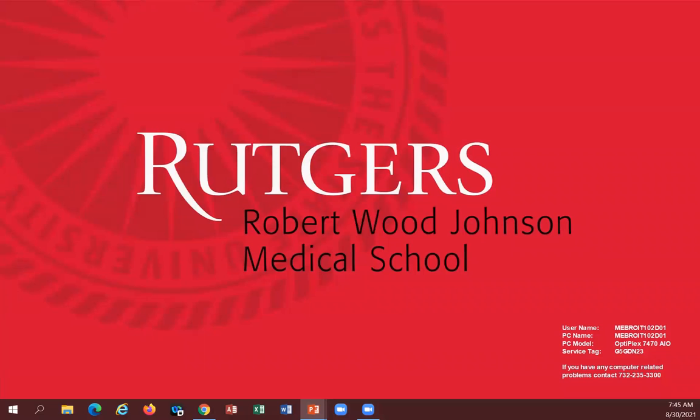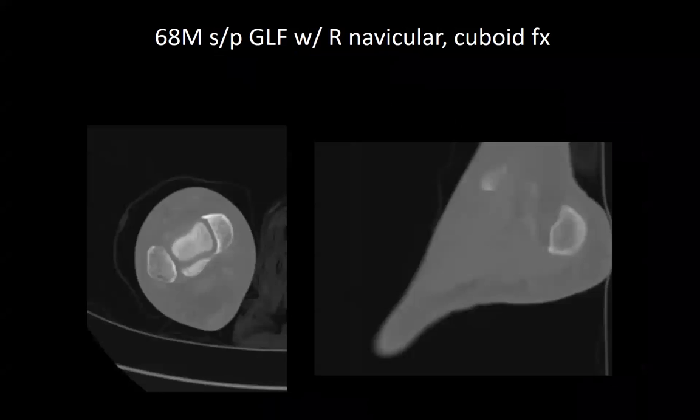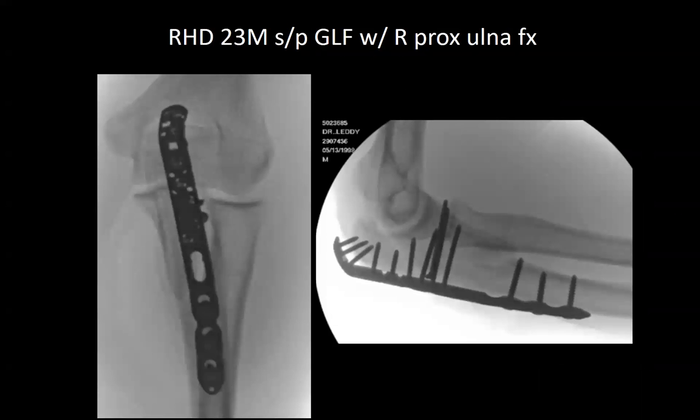The screws on the last case, it looks like they're going anterior to the bone. Do you have x-rays showing that they're in the bone? You mean anterior to the coronoid? You have better x-rays showing that that's definitely perfectly in the bone, right? Saying this one here? Yeah. When we took our set, this one doesn't look as good. But when we took our fluoro, we did it live, and we were able to see that we were in.